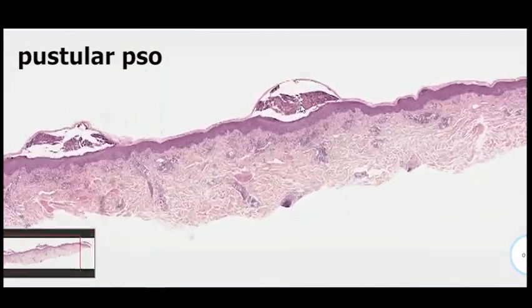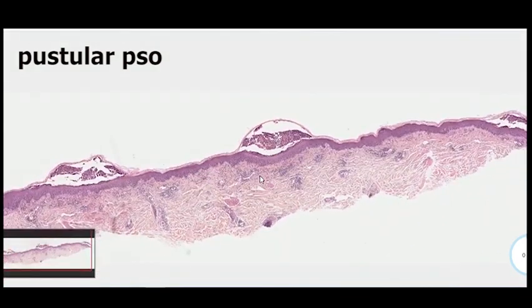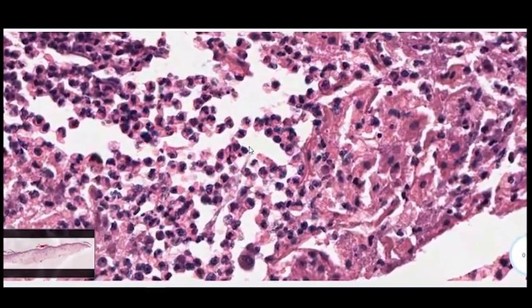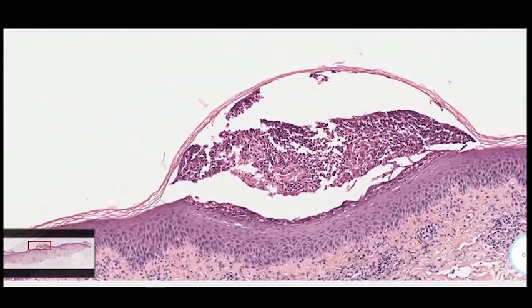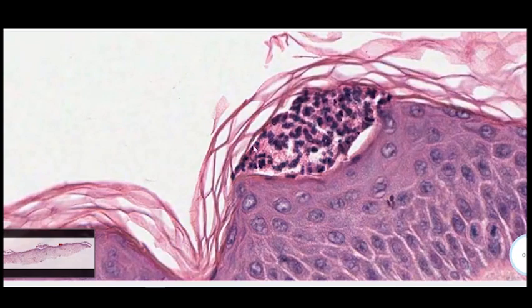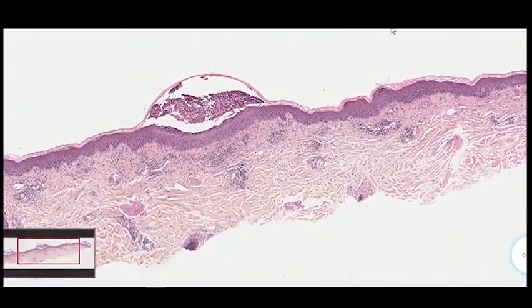Here is our stratum corneum, and you can find this large space which is filled with these nice neutrophils, all these ant-like structures or funny nuclei, multilobulated, the Mickey Mouse, they are all describing neutrophils. It can be a large subcorneal pustule, or it can be a small subcorneal pustule like this one. A collection of neutrophils below the stratum corneum. Okay. Thank you.